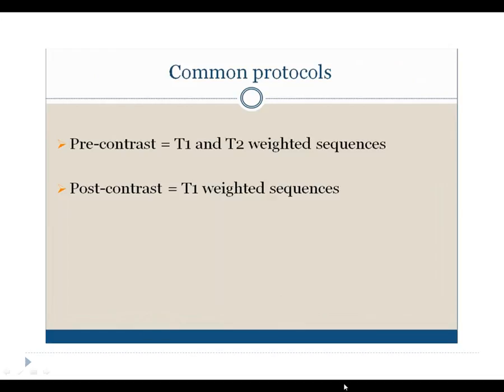In any MRI protocol where contrast is routinely given, we must always use a pre- and post-contrast T1 weighted pulse sequence. The way tumors and other pathologies enhance on the T1 images is how we can tell them apart from other structures. Having the pre-T1 weighted sequence acts as a baseline before the contrast is administered and is very important in determining pathology.